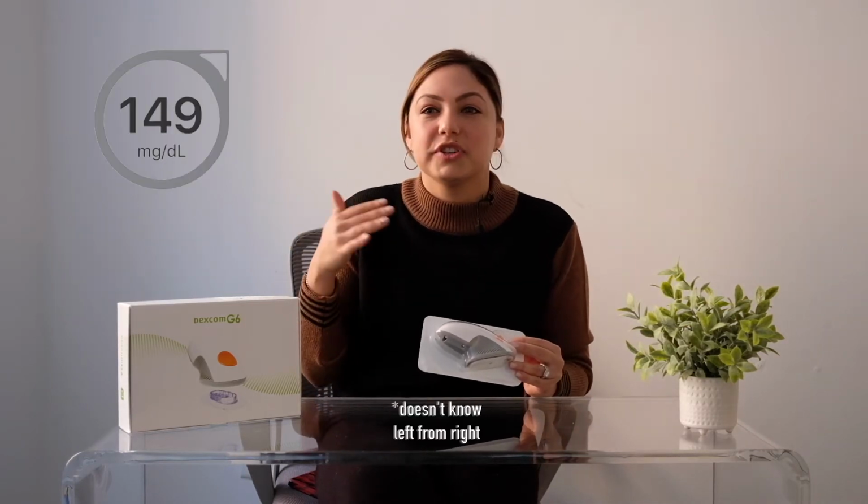The best part about it is that it shows you which way you're trending. So those will be your double arrows up or down or left or right. And seeing that trend changes everything, because imagine being, I don't know, 160 and thinking, oh, maybe I'll take some insulin. But if you see 160 with double arrows down, you know you're plummeting and do not take insulin. So those little changes have helped so much in my management of my diabetes.